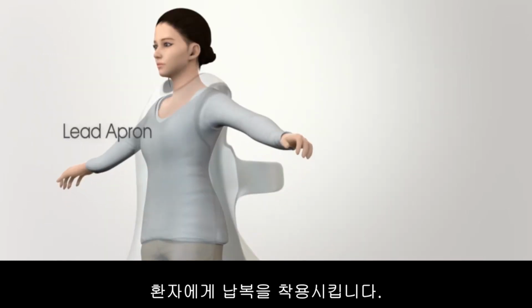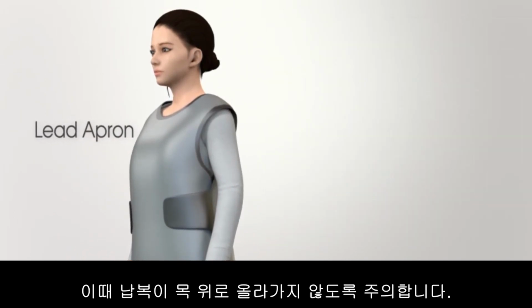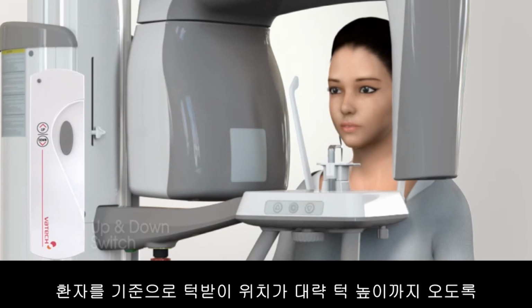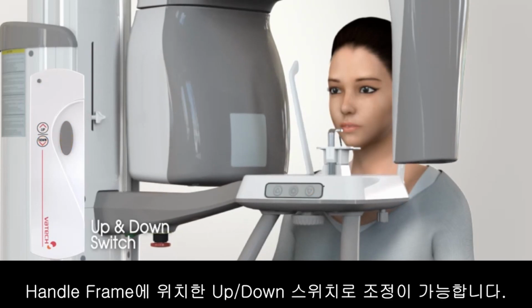Assist the patient to appropriately wear the lead apron. Be careful the lead apron is not above patient's neck. Ask the patient to stand in front of the handle frame. Adjust the chin rest position approximately to the height of patient's chin using the up-down switch. For PaX-i, the chin rest position can be adjusted using the up-down switch on handle frame.